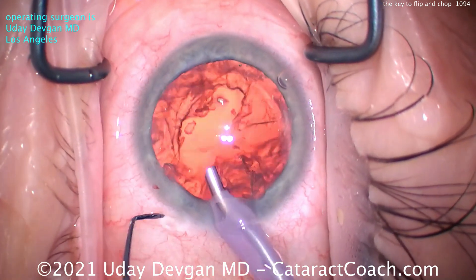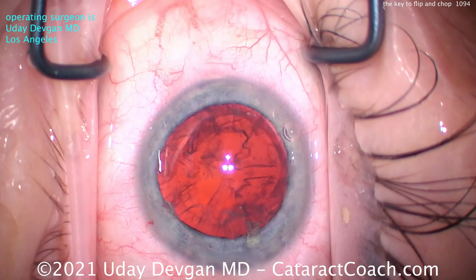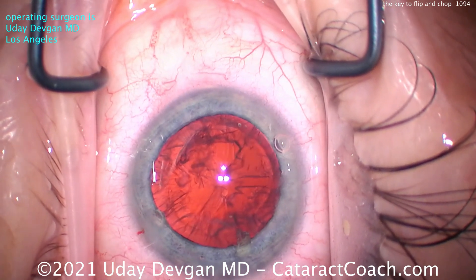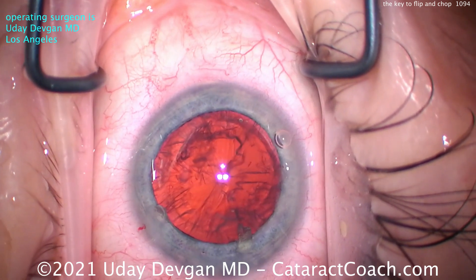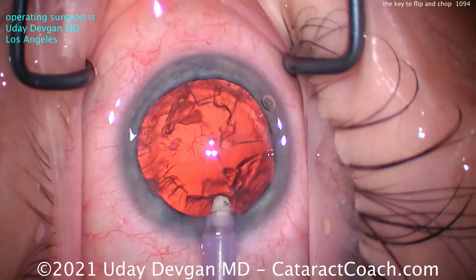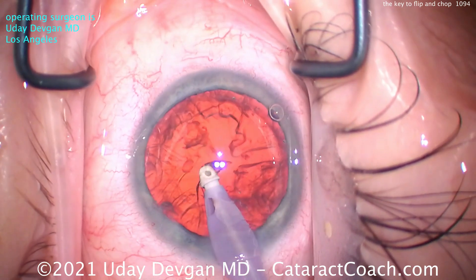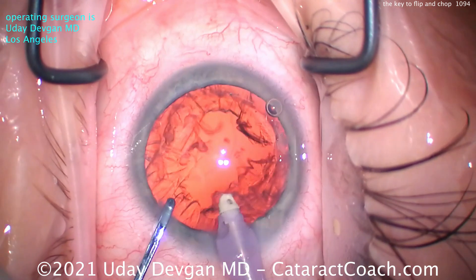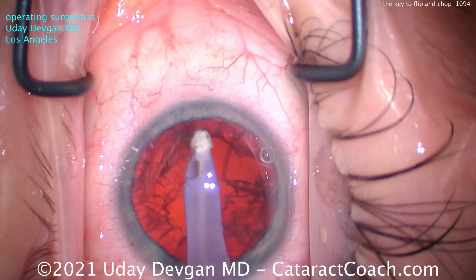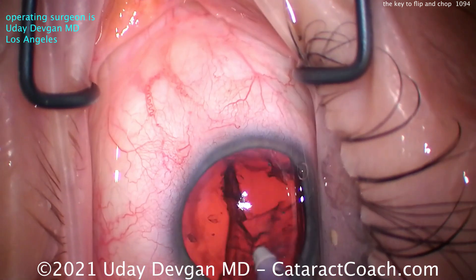Easy breezy. Now let's clean up the cortex. The advantage of flip and chop is that for a softer nucleus — 2-plus NS or less — it is fast and efficient, keeps away from the posterior capsule, and because it's a soft nucleus, there's really minimal or no FACO energy needed, so there is no corneal edema on post-op day one. Let's clean out that cortex, nice and easy.